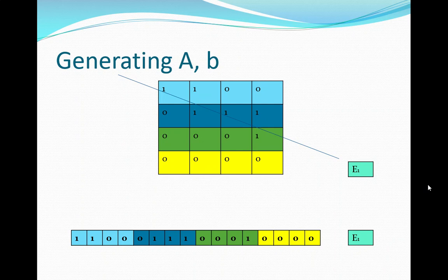I could theoretically go in and figure out what that exact path length is and then do an adjustment to it. So now the question is one of efficiency. Does doing that correction greatly improve the quality? It absolutely improves the quality. But the time that it takes and the cost right now is prohibitive. Okay. So this is one of those things, I don't want to say no.